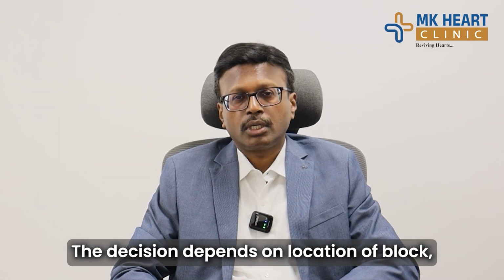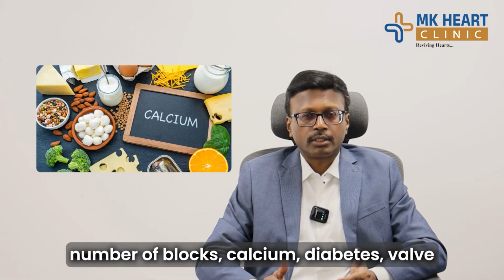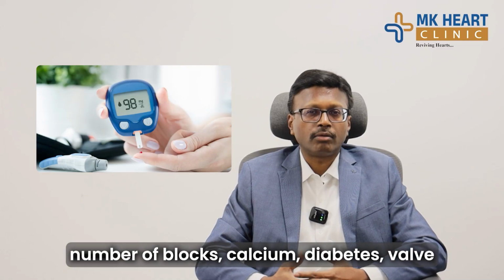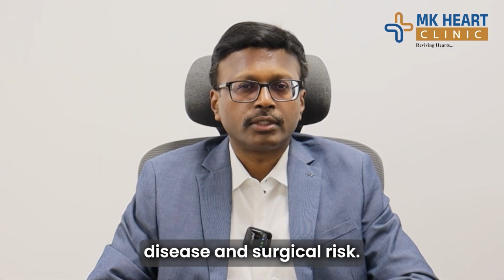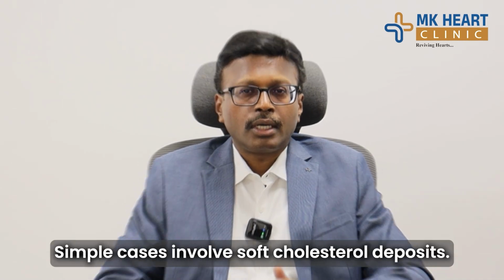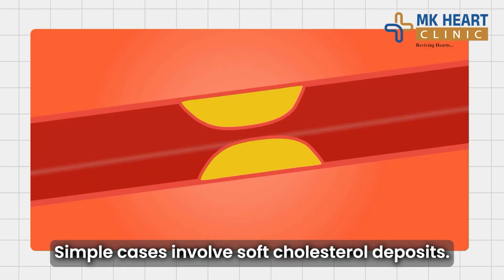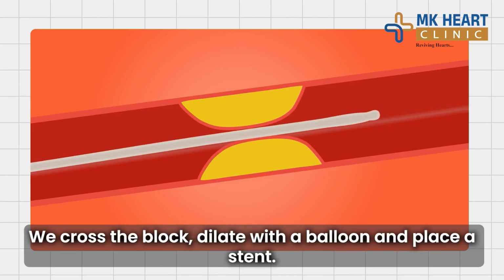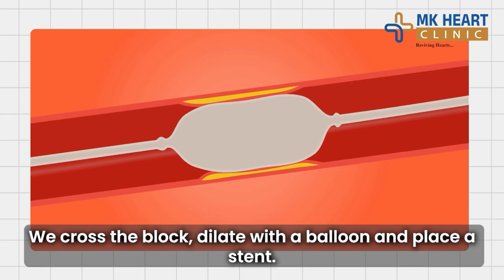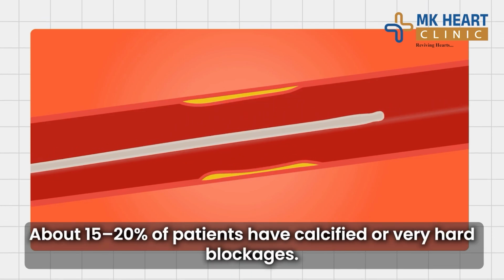This depends upon the location of the block, multiple factors, what is the patient's risk, whether there is any calcium, long-standing disease, diabetes, whether there is any mitral valve lesion. So 4-5 factors will decide whether that particular patient needs either angioplasty or bypass surgery. In a simple, straightforward angioplasty, there is a block which is made up of only cholesterol. So normally we cross the lesion with the wire and then dilate the lesion with a balloon and then implant the stent. Since the cholesterol is a very soft material, this is called the straightforward angioplasty.